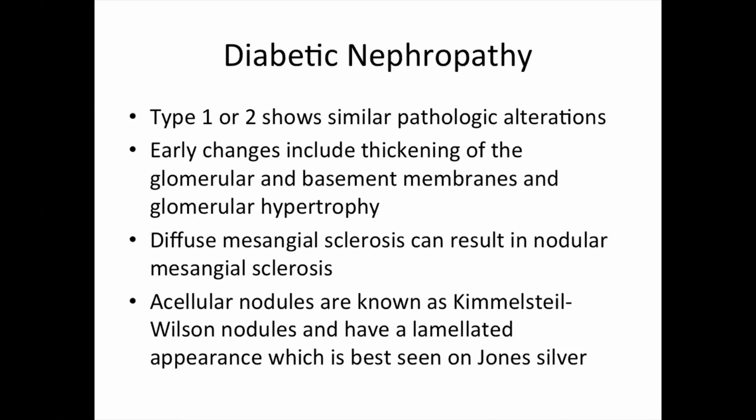It's basically called IgG accentuation on the glomerular basement membrane as well as the tubular basement membrane, but it is not positivity. The intensity is not there. It's only accentuated. Okay. Right.